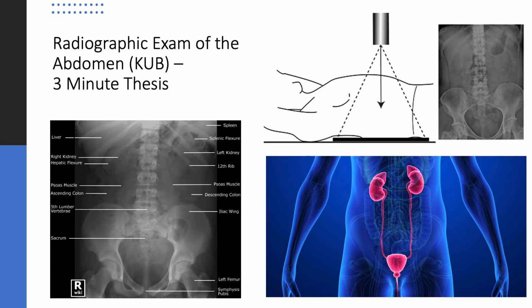Also, like other ionizing procedures, it is important that this exam is not done if the patient is pregnant, has an IUD, or if they have a specific medical condition that would cause harm if the procedure is done. Some other things that should be mentioned before beginning the procedure is whether or not the patient has had a barium contrast X-ray within the previous 4 days, or if they have taken any medications like Pepto-Bismol, which can interfere with the X-ray.